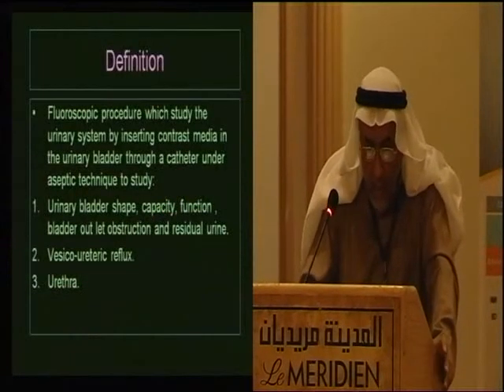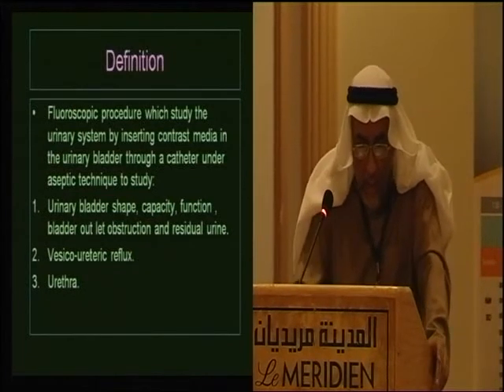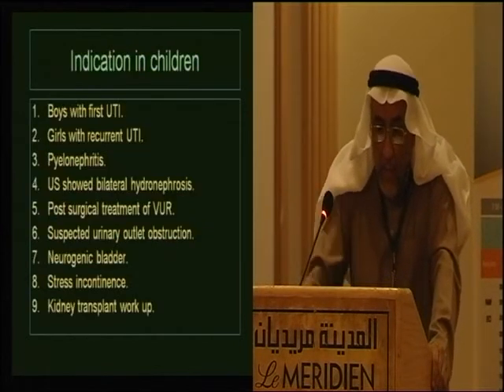Bismillah ar-Rahman ar-Rahim. I think everybody thinks he can do a good job with the VCUG. It is just a fluoroscopic procedure to put contrast in the urinary bladder. Then we start to study the urinary bladder, shape, capacity, function, and see if there is reflux, and see the urethra. I think it is deeper than this.